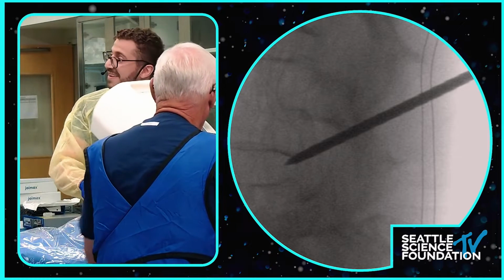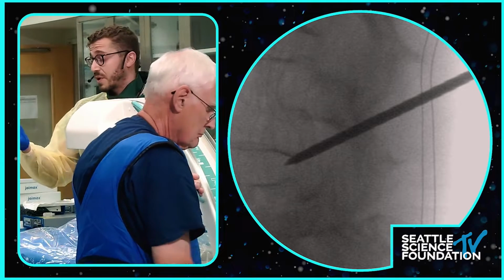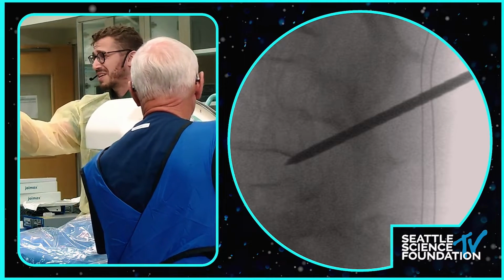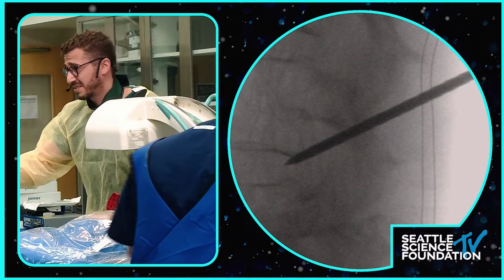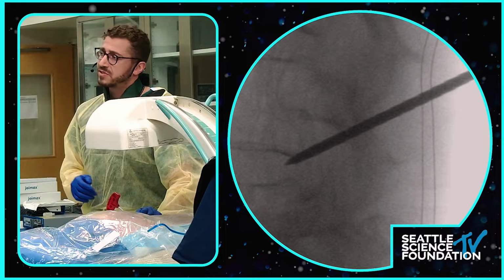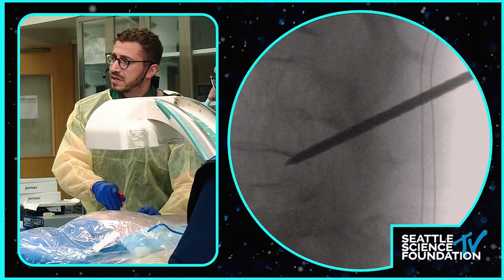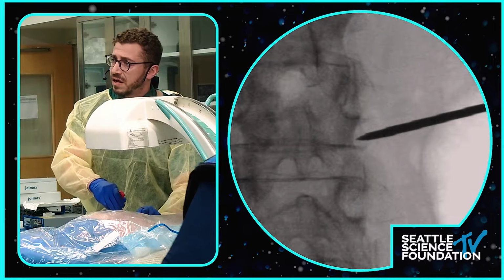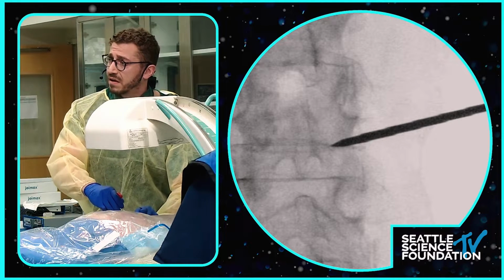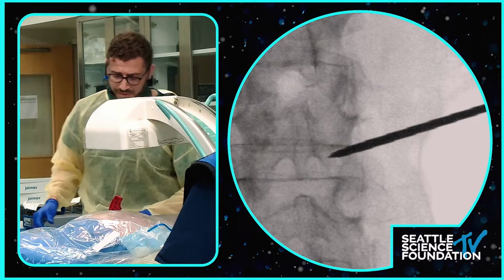Osama, are you doing these on a Wilson frame or a Jackson table? That's a great question. The Wilson frame is the best because it opens up the foramen more. In a patient like this, the foramen is humongous, so you could do it either way, but it's probably best to do it on a Wilson frame just to enlarge the foramen. AP, please. AP. Okay. All right. Can we do a lateral here, please?